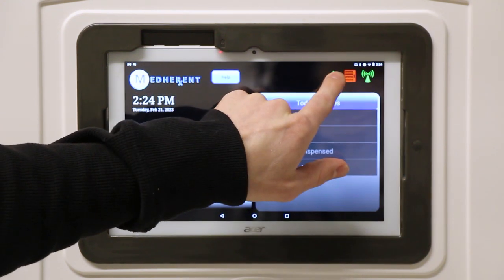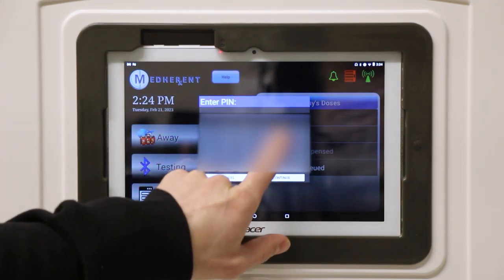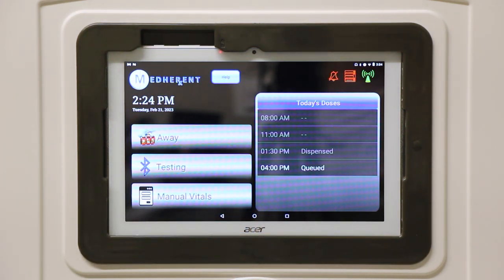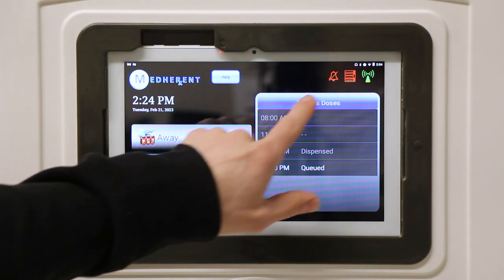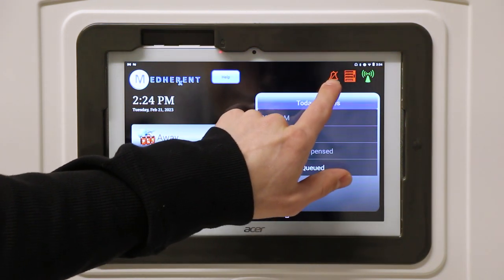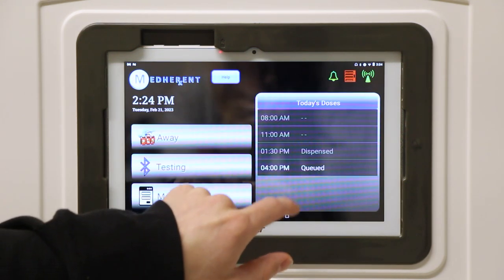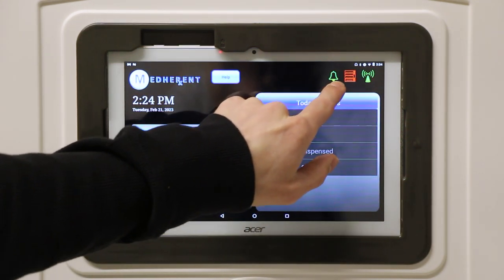Just tap and hold the bell icon for a second and you will be prompted to enter your administrative PIN number. Enter your PIN number and push Continue. The bell icon should now be red, which indicates the alarm is off. If you would like to turn it back on, simply press and hold the icon, enter the administrative PIN, hit Continue, and the alarm will be activated. The icon is now green.